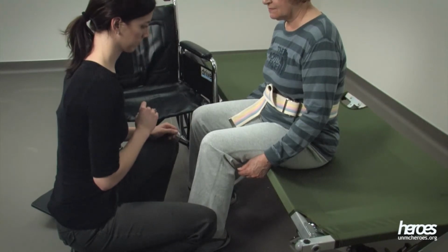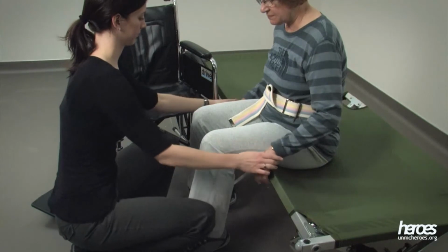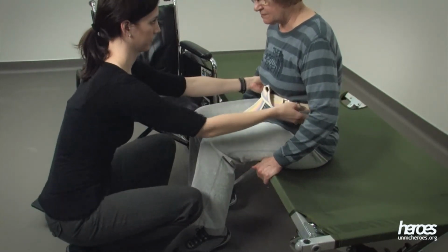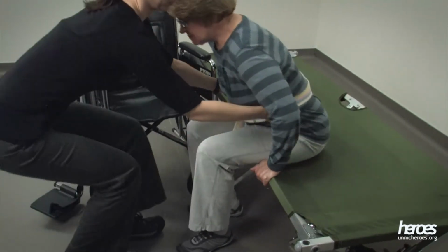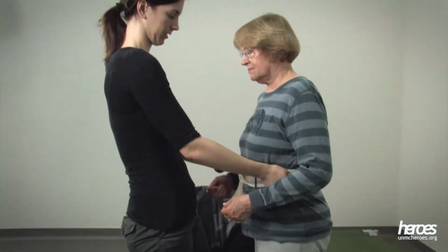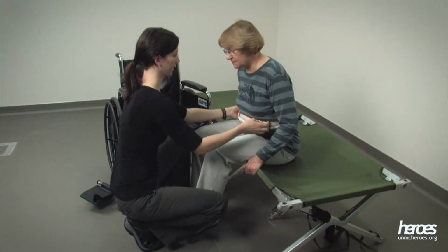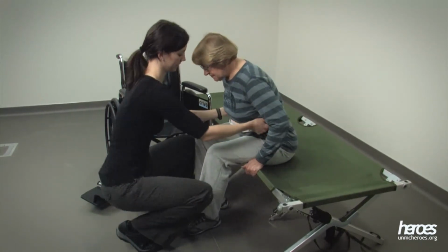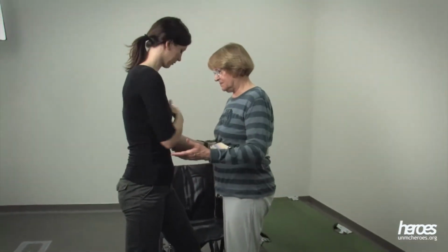Next, to help the individual stand, have them place both their hands forward on the cot. Then place your hands on the gait belt on either side of the trunk using an underhand grip. Instruct the individual to lean their trunk slightly forward and to push through their arms and feet to stand. When ready, encourage the individual to bring their nose over their toes. Use terms such as ready, set, stand, or 1, 2, 3, stand to coordinate with the individual.